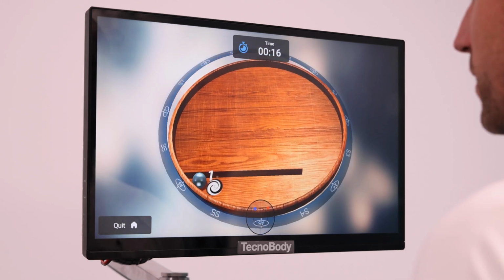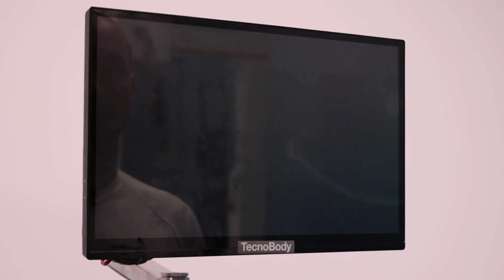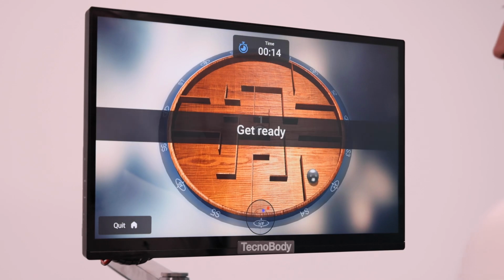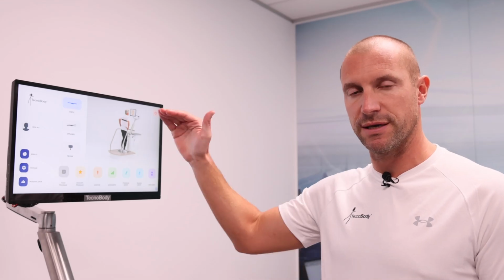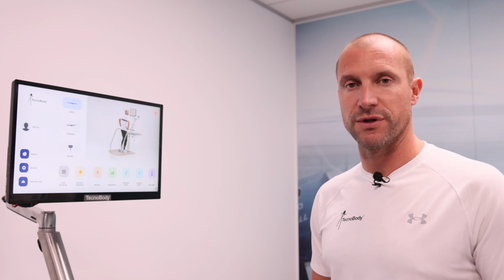After reaching the goal, eventually, and according to the time, the software will provide the second level, so increasing the difficulty of the exercise. It's possible to perform the exer games in all the 3 modes of the ProKin, so in static, dynamic and dynamic for the trunk. We're just going to change the goal of the training, so if you want to work on the static balance recovery, of the dynamic balance, or to improve the mobility of the trunk.